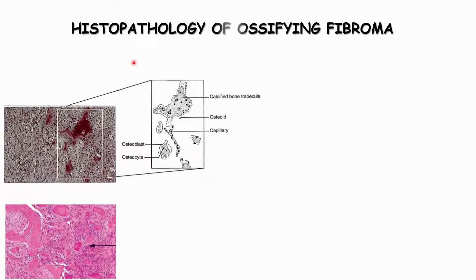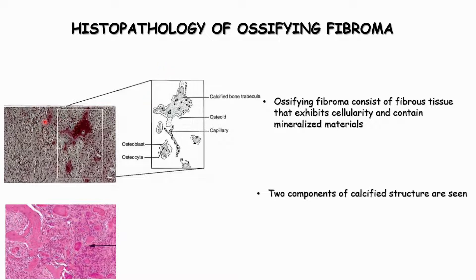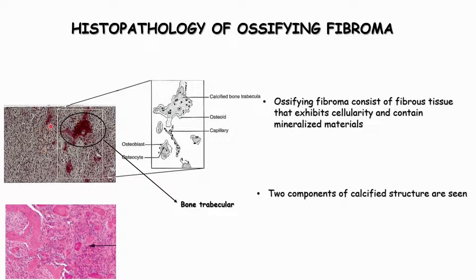Today we will be seeing the histopathology of ossifying fibroma, which is a fibro-osseous lesion consisting of fibrous tissue that exhibits cellularity and contains mineralized material. It majorly has two calcified structures: bony trabeculae and cementum-like structure.